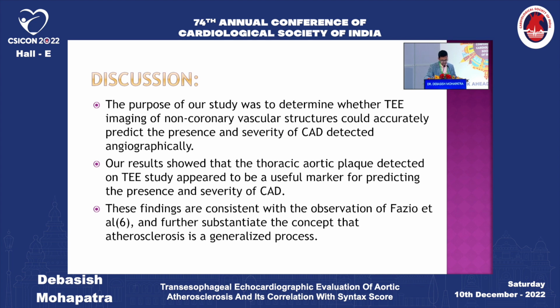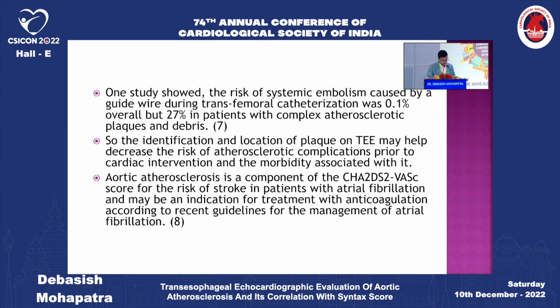Our results showed that thoracic aortic plaque detected on TEE study appeared to be a useful marker for predicting the presence and severity of CAD. These findings are consistent with the observation of Fazio et al. and further substantiate the concept that atherosclerosis is a generalized process.